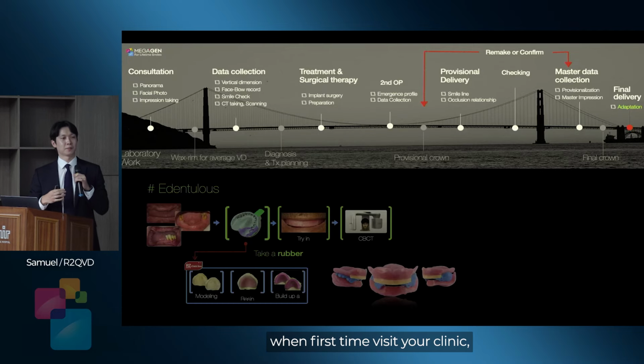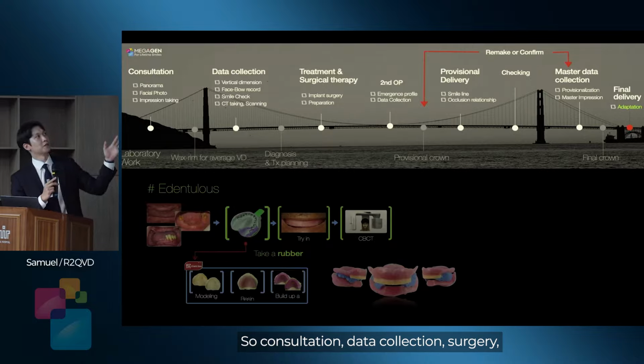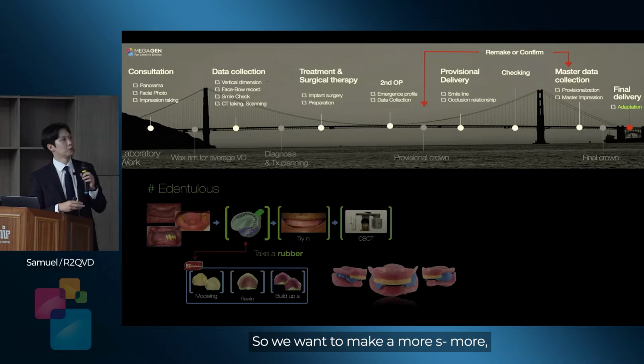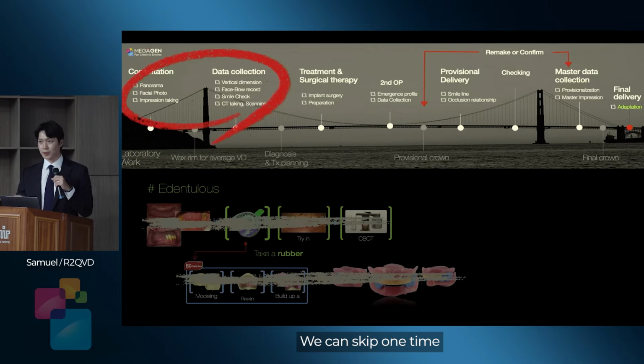Usually, from the first time your patient visits your clinic to the final delivery, normally they have to visit your clinic 8 times: consultation, data collection, surgery, second operation, something like that. So we want to make a more minimal investment. With this one, we can skip 1 visit.